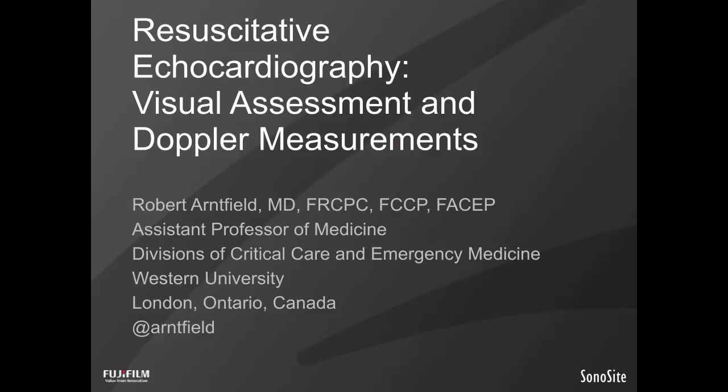And something I've noticed over the past several years that I've been teaching this modality is that there's increasing interest in the point of care echocardiographers out there in understanding where and when and how to apply a quantitative approach to point of care echo. And I've struggled with this topic a little bit along in my own journey insofar as learning these skills and really trying to find the right place for them.